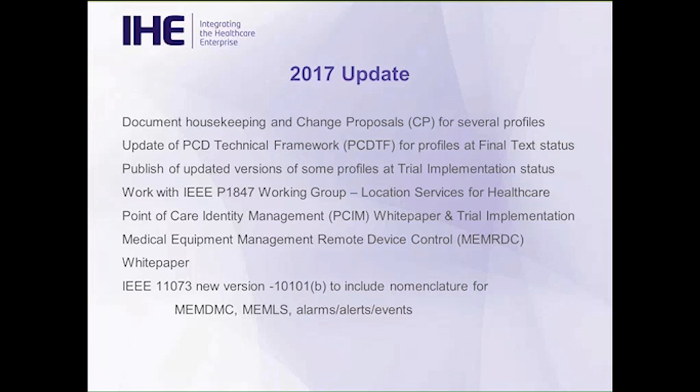We are working with the IEEE P1847 Working Group on Location Services for Healthcare. They're focusing on common terminology and the technology associated with location identification. And we've pretty much got the means of communicating that data within healthcare already within the MEM-LS profile within PCD. As I mentioned earlier, there's the point of care identity management. It's a new white paper, and we're hoping to come up with a trial implementation of that for this cycle.